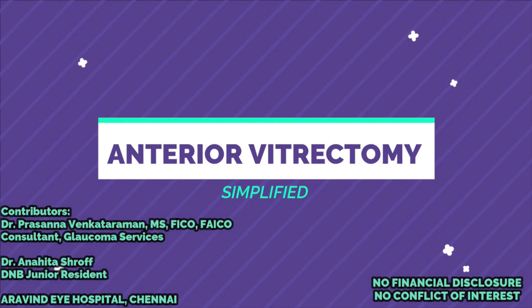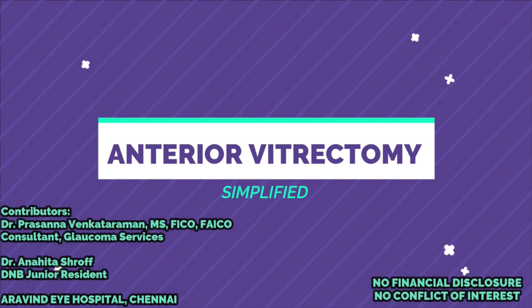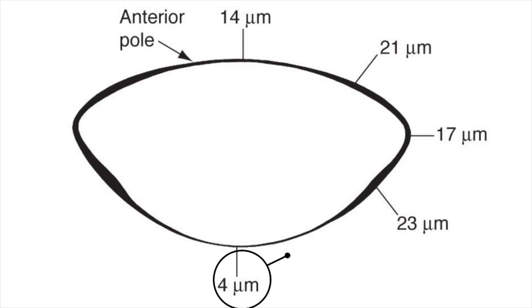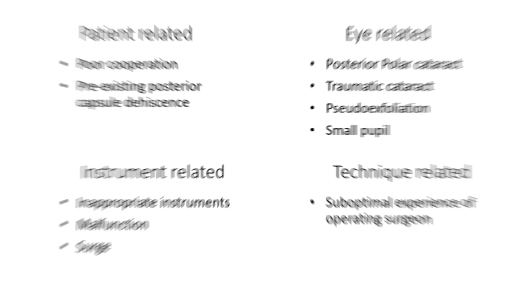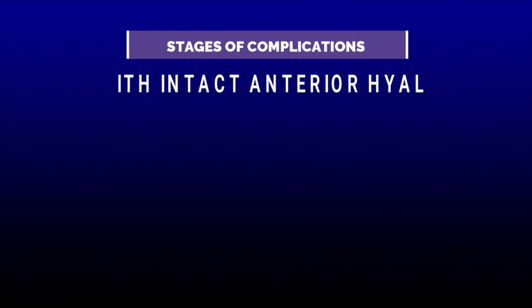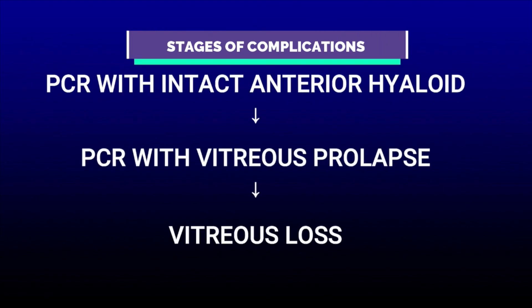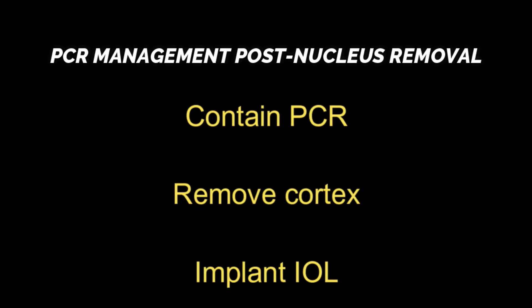This video is aimed at simplifying and demystifying anterior vitrectomy. The reasons for posterior capsule rupture (PCR) are endless as enumerated here, showing how small the margin of error is during surgical manipulations. It is best to contain the PCR with minimal vitreous loss and avoid retained lens fragments. This video will demonstrate management of PCR post nucleus removal and highlight how to perform anterior vitrectomy, remove cortex, and implant an IOL successfully both in FACO and SICS.